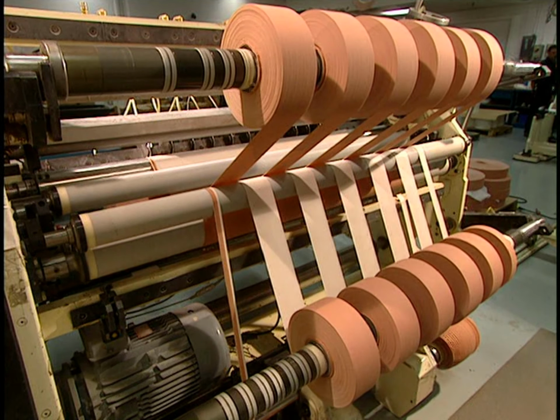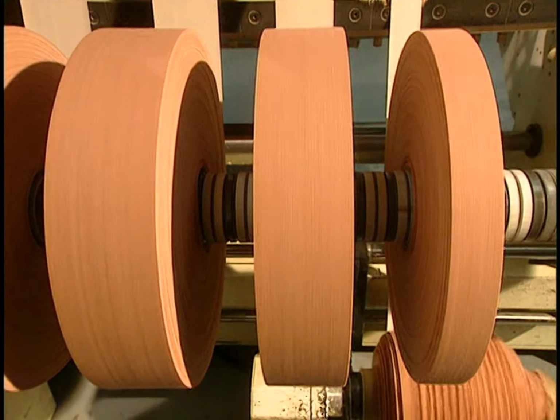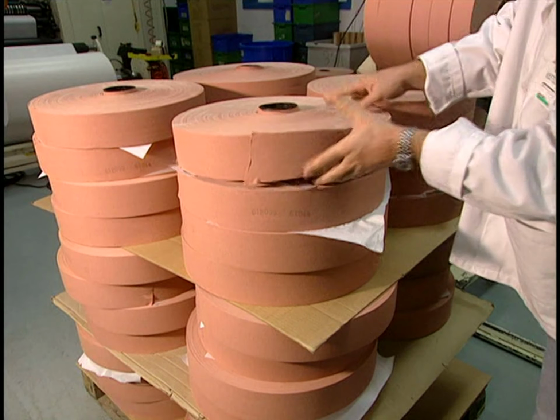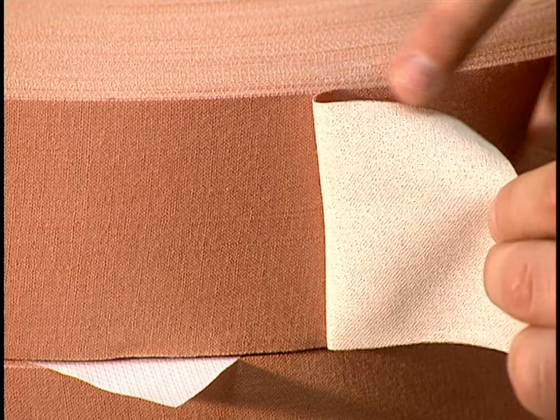Bandages are different sizes. These blades cut the glued rolls into strips of varying widths. These rolls are taken away and stacked, ready for the next step, application of the little cushion protective pads.